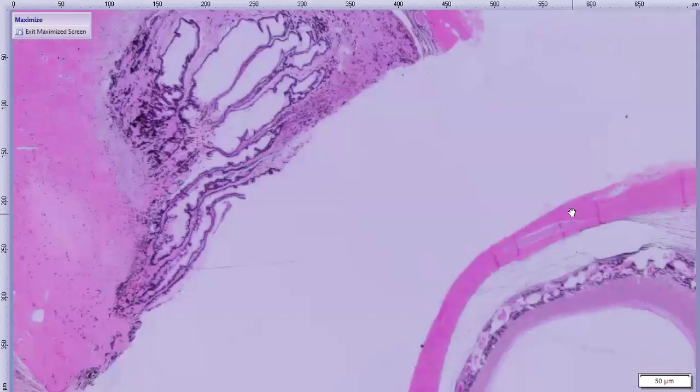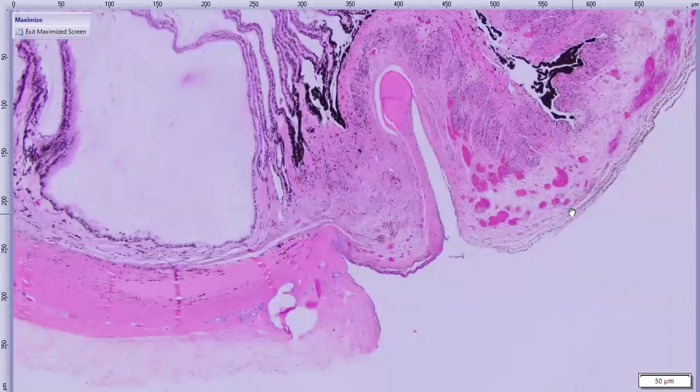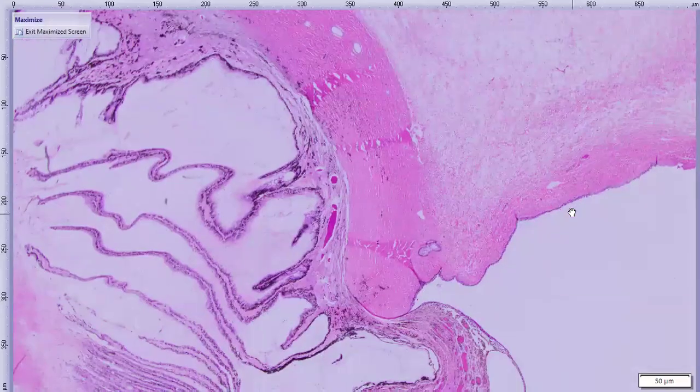All right. That's our little gonio slice. We'll focus on the main globe. See if we can actually find recognizable cornea for you. It's hard. You kind of can't.